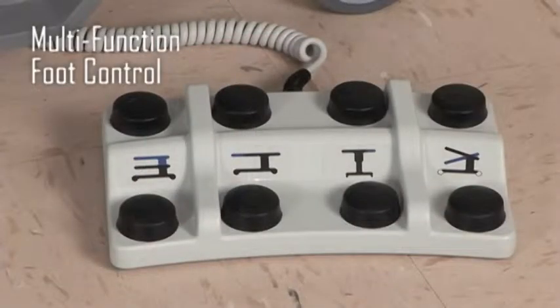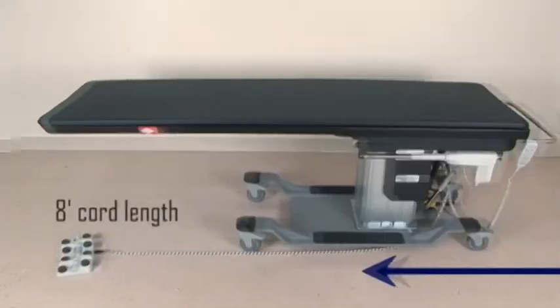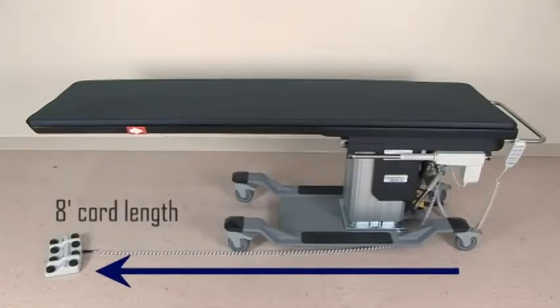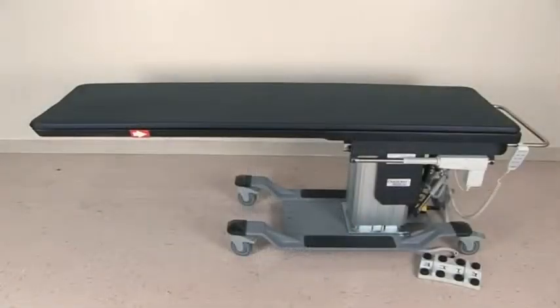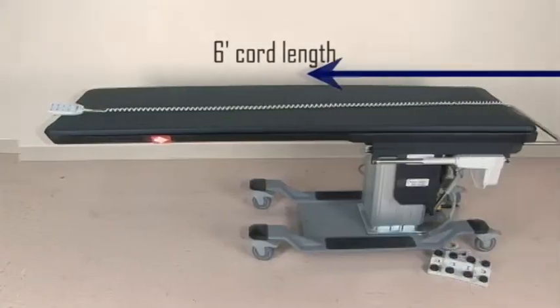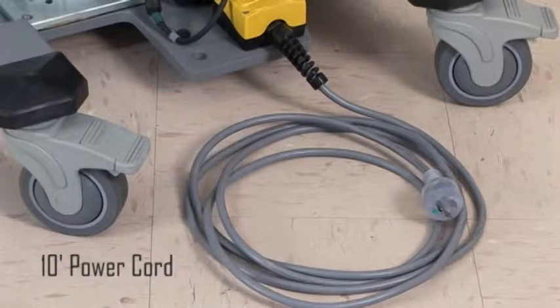All movements are accessed by the foot control with clearly marked functions and the 8 foot cord length allows you to position it where it is needed. The multifunctional hand control gives you the flexibility to have a tech control the table positioning with its 6 foot cord length. The 10 foot power cord allows you to position the table where you need it in the room without getting in the way.